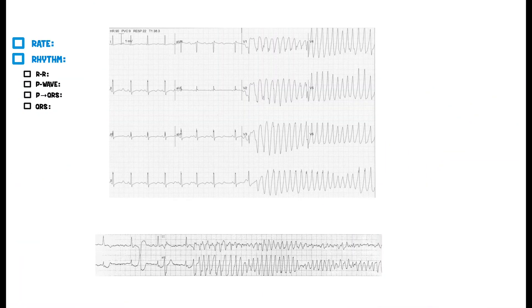All right guys, let's go ahead and take a look at this next EKG. We're going to try to determine the rate, the rhythm, and find out what type of rhythm this is. This is a dangerous rhythm you don't really want to ever see, but if you do it's pretty cool because it's an interesting and pretty rare one.